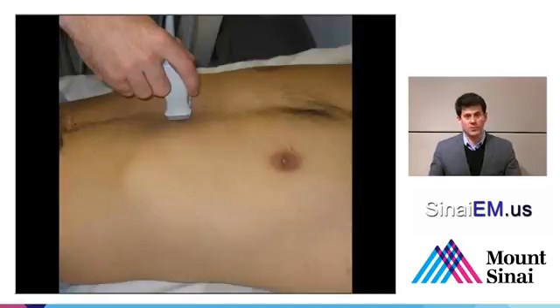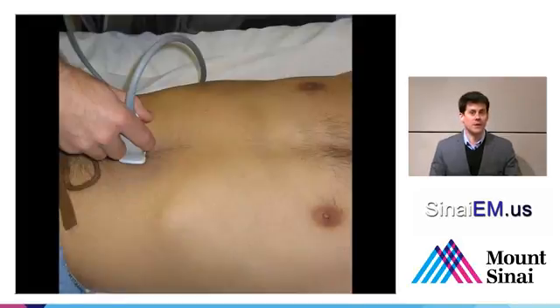So let's start with the probe in a transverse orientation. You're going to start just below the xiphoid process, relatively in the midline, and aim the probe marker towards the patient's right-hand side. And we're going to start in the subxiphoid area and scan inferior towards the feet, right about to the level of the umbilicus. And that's going to give us a view from celiac axis all the way down to the iliac bifurcation.